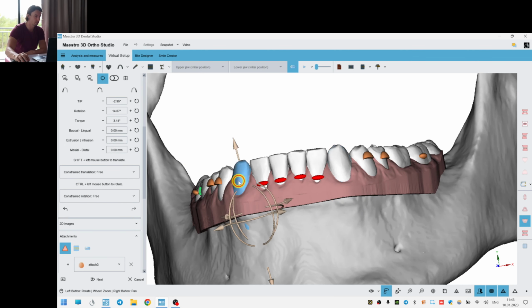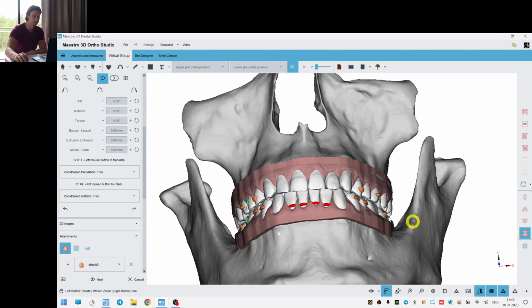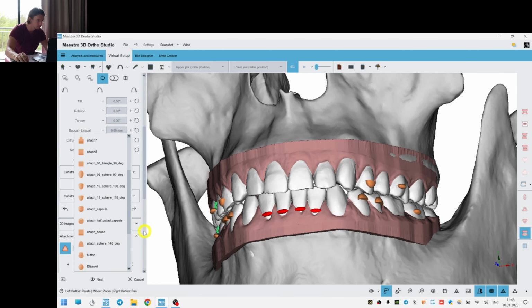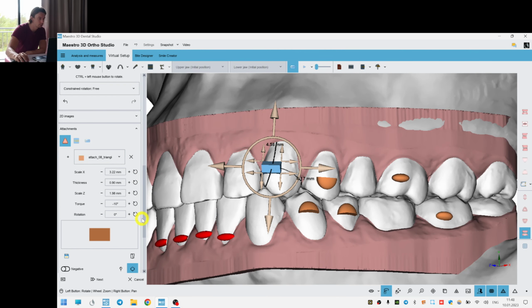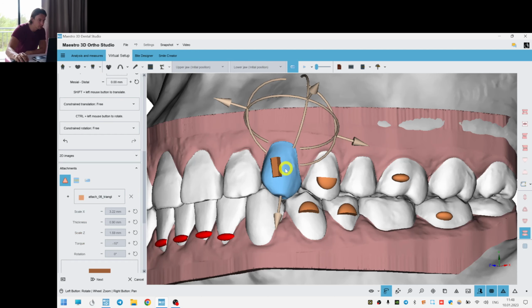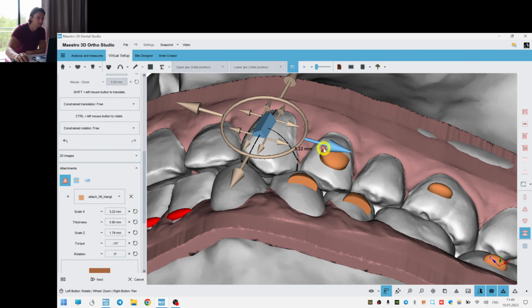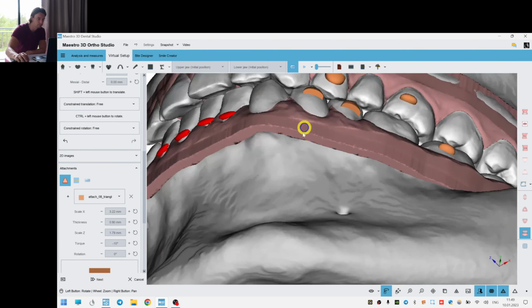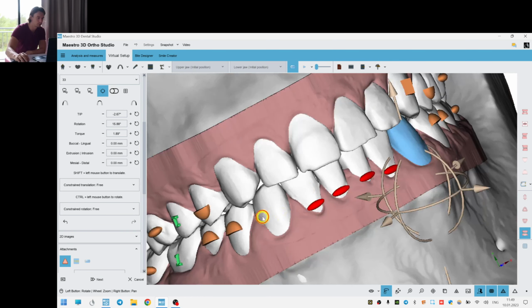Do we need some attachments for the canine rotations? Yes, we definitely do. Three of them. I usually use this kind of triangular attachments. If the rotation is to the mesial direction, we place it more to the mesial part of the teeth. Let's reduce the size. Here we have mesial rotation as well, and here the same.